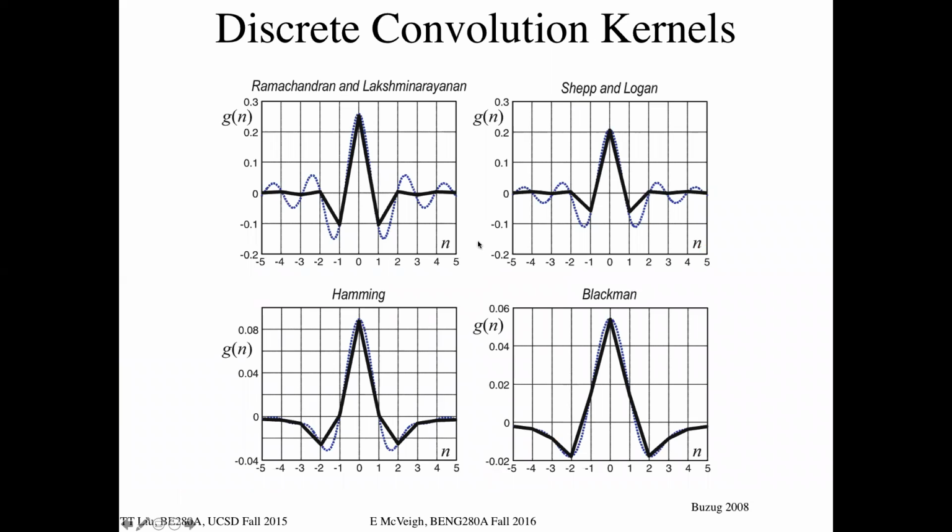The convolution kernels can be approximated by discrete points that you convolve your projections with. In the early days, it was important to do this as accurately as you could, quickly, in order to make a picture in a reasonable amount of time. You have to remember, array processors, as they were called back then, which is what graphics cards used to be called.